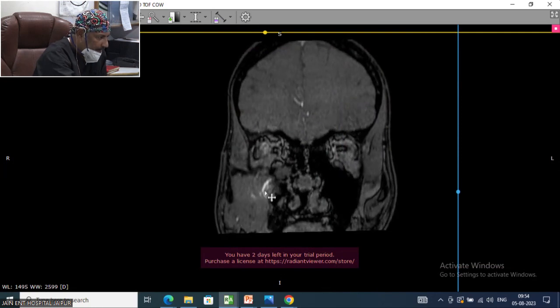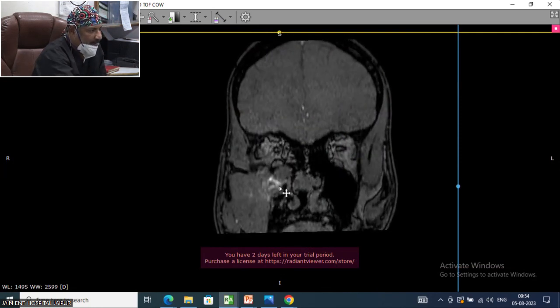That is the internal maxillary network. And see, this is the maxillary artery. Can you see the maxillary artery here? Yes. This is the level of the palate. Again, this is very important sometimes, otherwise it is so difficult to find the maxillary artery.